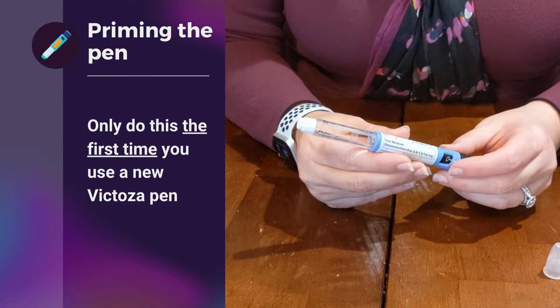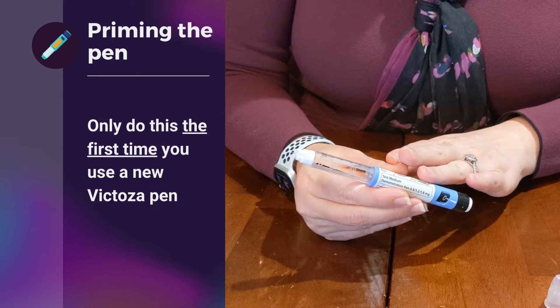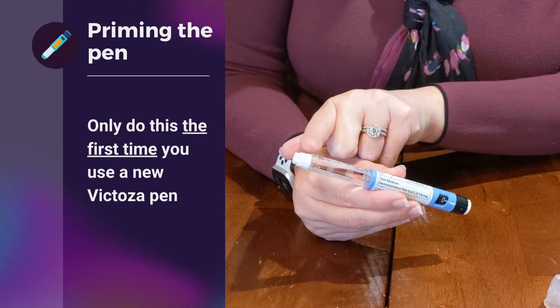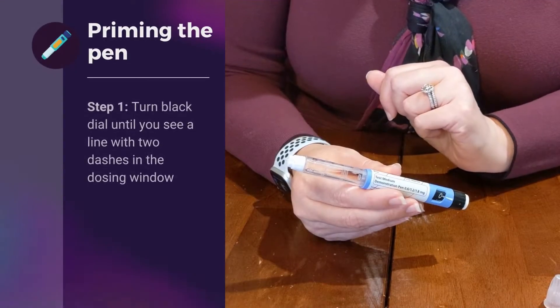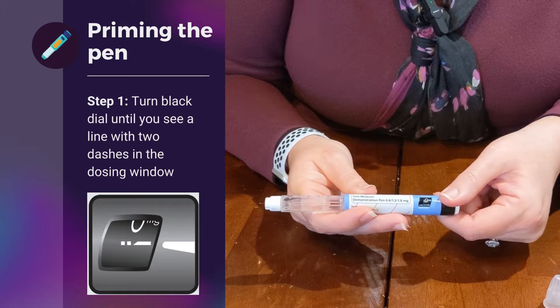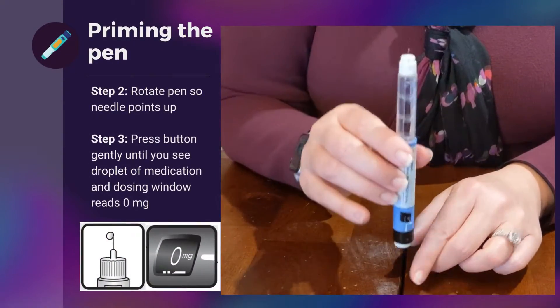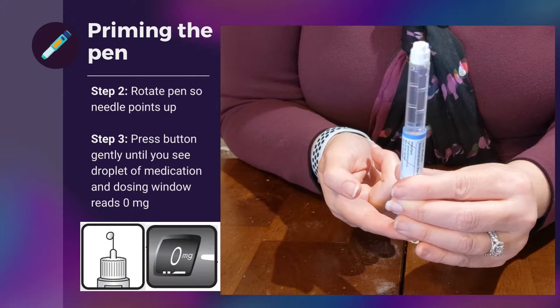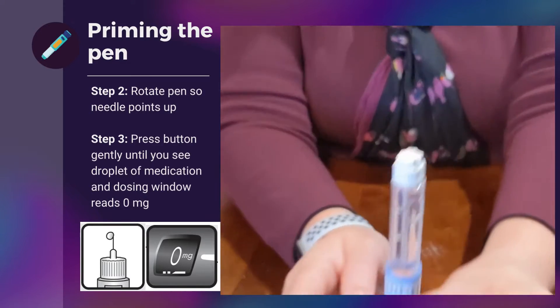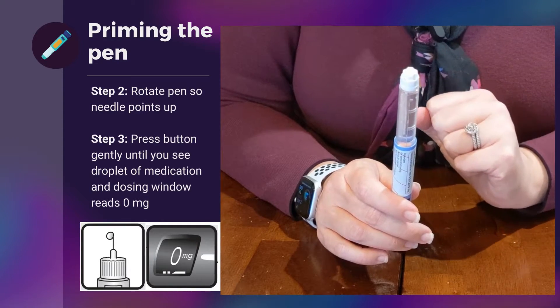The Victoza pen requires priming the very first time you use the pen. This is different from insulin pens — it only needs to be primed the very first time you use it, even though you'll be using a new needle for every single injection each day. To prime it, look at the dosing window and take this black portion and turn it until you get to the line with two small dashes. Once you're there, point the pen up so the needle is facing up and press. Hopefully you'll see a drop of Victoza come out — that tells you the pen is properly connected and primed, and you're ready to give your first dose.